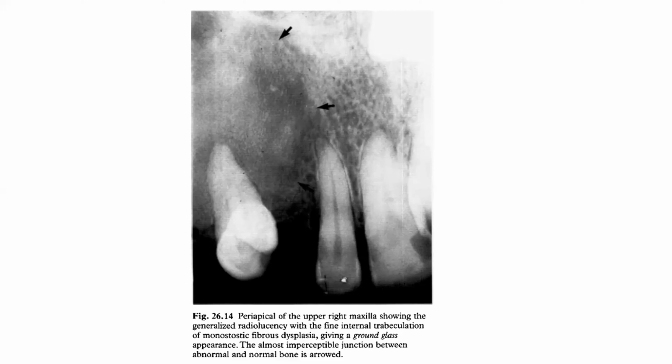The adjacent teeth sometimes can be displaced, but rarely resorbed. There's also buccal and lingual alveolar expansion and encroachment or obliteration of the antrum. Involvement of the adjacent bones, including the base of the skull, is also possible.